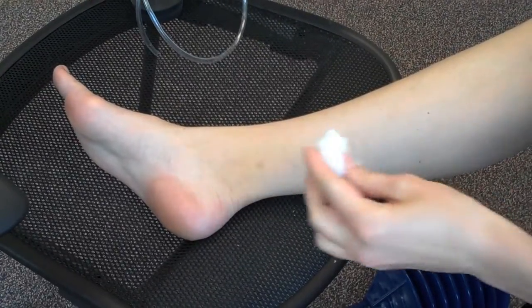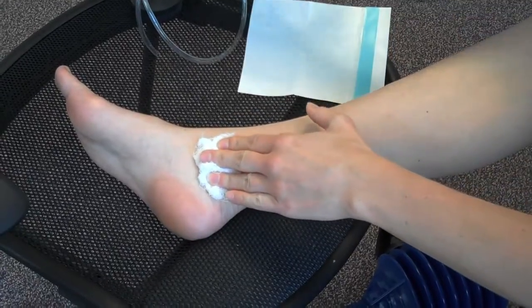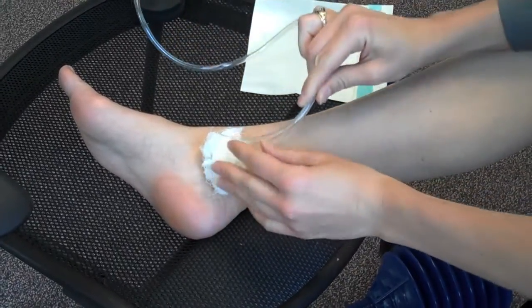First, you dress the wound with a gauze or sponge, or whatever you may have in hand. Then, insert your drainage tube.